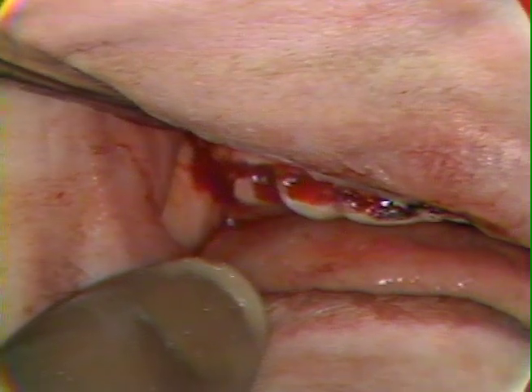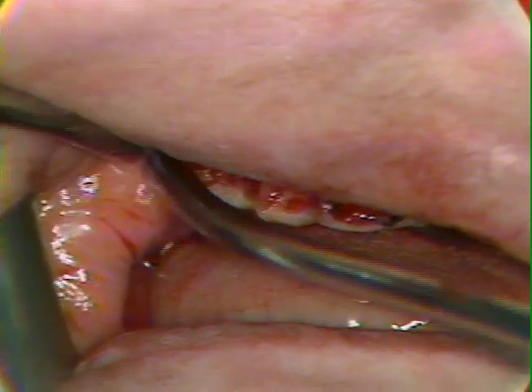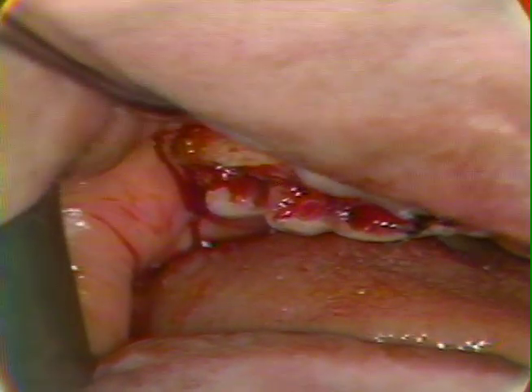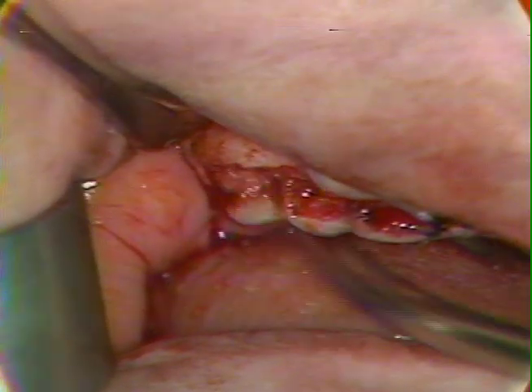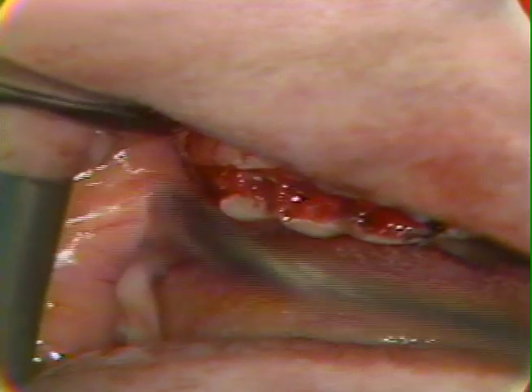So that accounts for the multi-rooted molar, and we next will examine, perhaps with that retractor we can see a little better, these remaining contours on the buccal. We'll trim that extra soft tissue, but all this buccal plate has been preserved, and that might have been fractured if we had merely put the forceps, a molar forceps, on that isolated remaining molar.